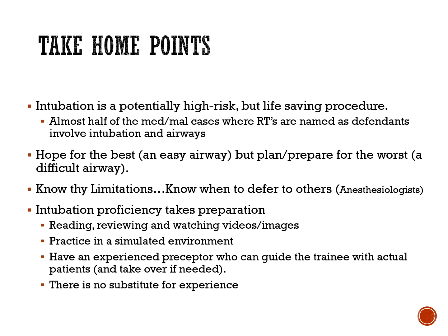Intubation proficiency takes preparation. So reading, reviewing, watching videos and images, practicing in a simulated environment. It could be a sim lab, but it can just be in a mannequin's head. So you don't have to have a whole sim lab. More and more academic healthcare institutions have sim labs or have access to simulation labs.